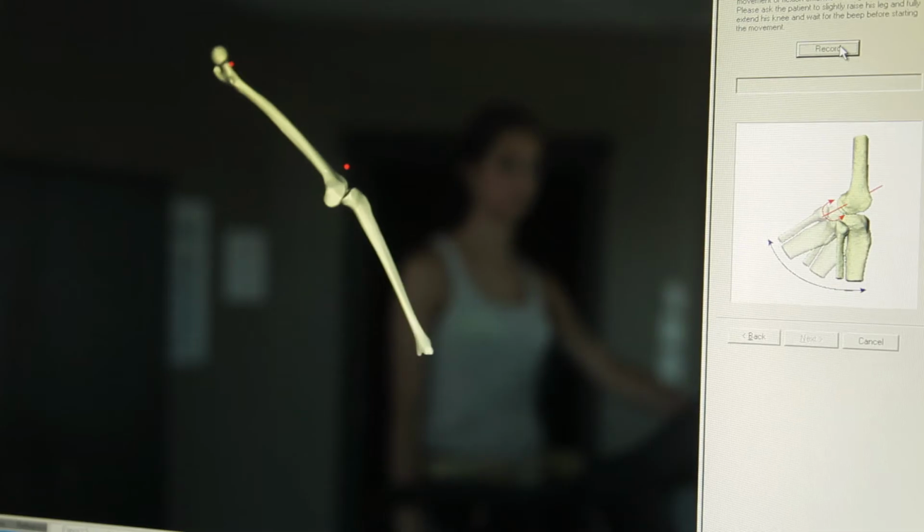So with this new way of examining a functional knee, it's definitely a process that is going to help my colleague doctors, and I also believe that it's a very, very helpful tool to help evaluate patients for the physiotherapist, as well as following their treatment.